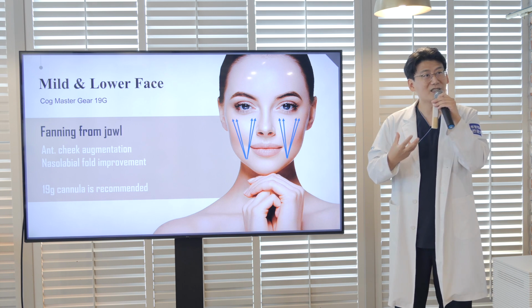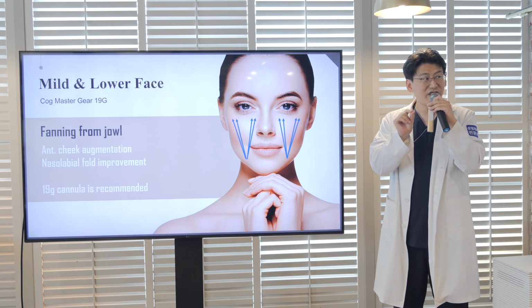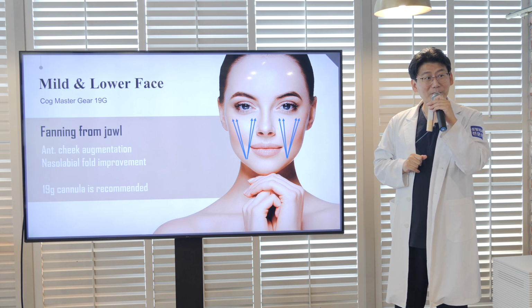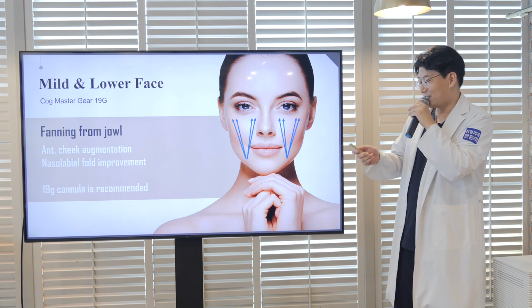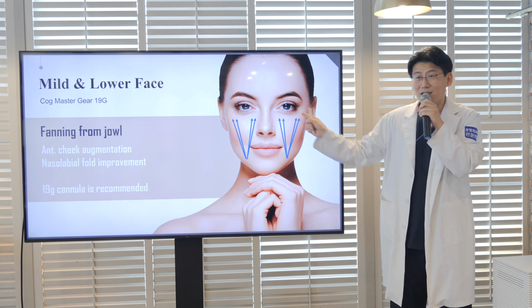They complain of foreign body sensation. So you should choose thinner thread to reduce the complaint from the patient. It's also very important. You should control the complaint of your patient. So I prefer a 19 gauge cannula for this application.